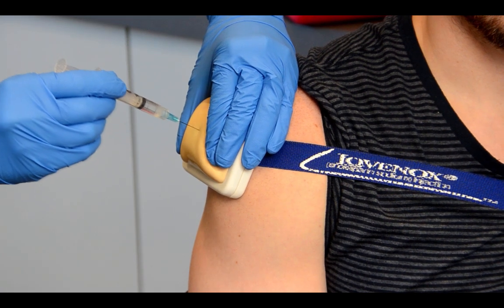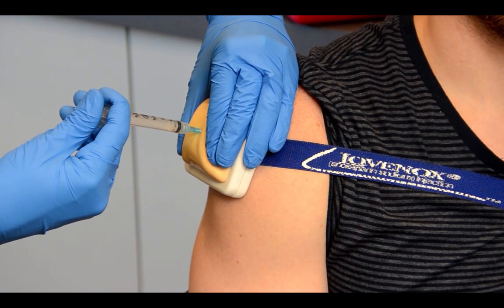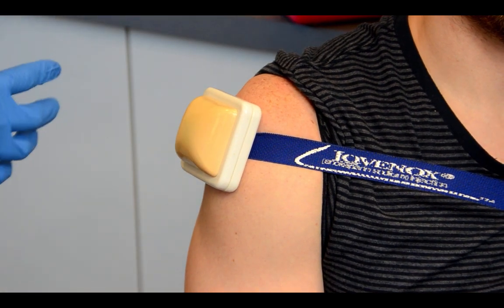Then pinch the muscle to form a firm surface. Insert the needle at a 90 degree angle and inject the dose of medication. Remove the needle and dispose of it properly. Do not recap your needle. Now that the dose has been given, the patient should start to respond within three to five minutes. However, if they're not responding, it is safe to give a second dose of naloxone in an alternate injection site if you have another dose available.